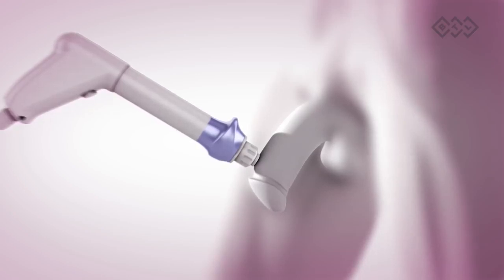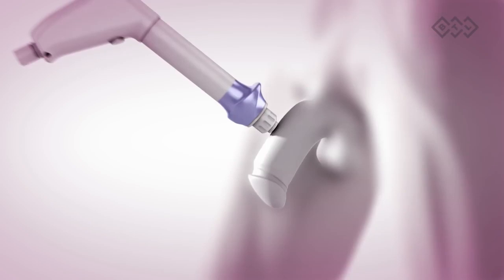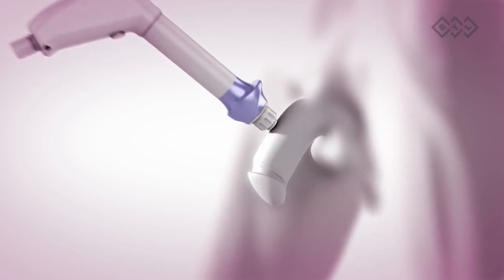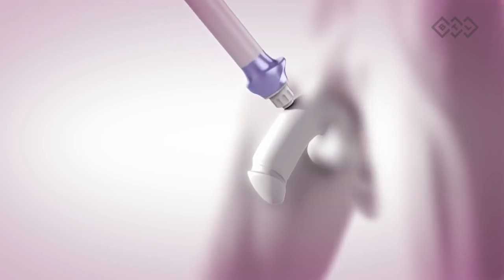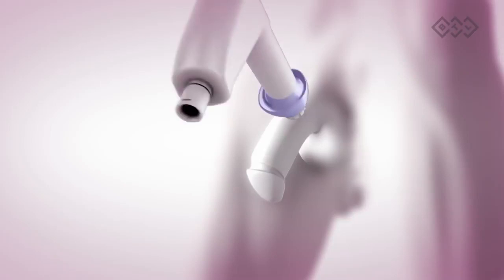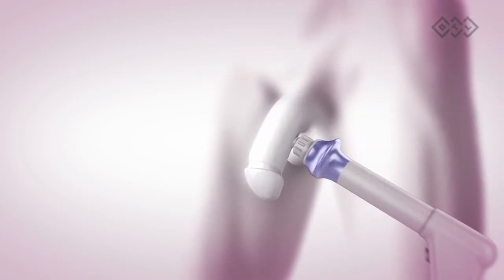Start by applying the shock waves on the dorsal side of the penis at 3 points along the penis, dividing the whole length approximately into thirds. Start at the most distal part of the penis and continue as shown in the video. Next, treat the penis from the left and right of the ventral side. Apply shock waves approximately at the midsection of the penis.